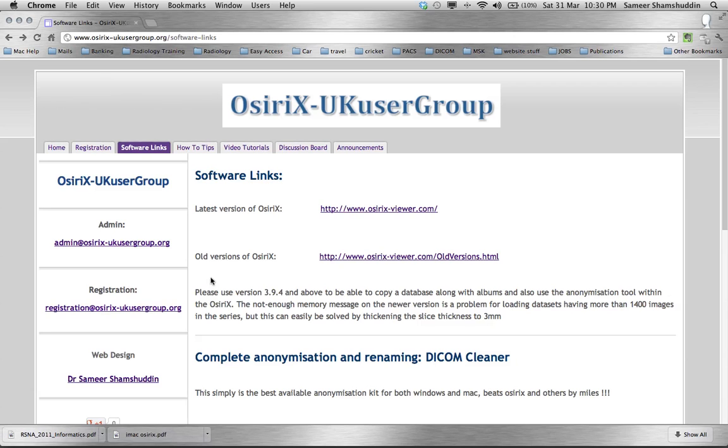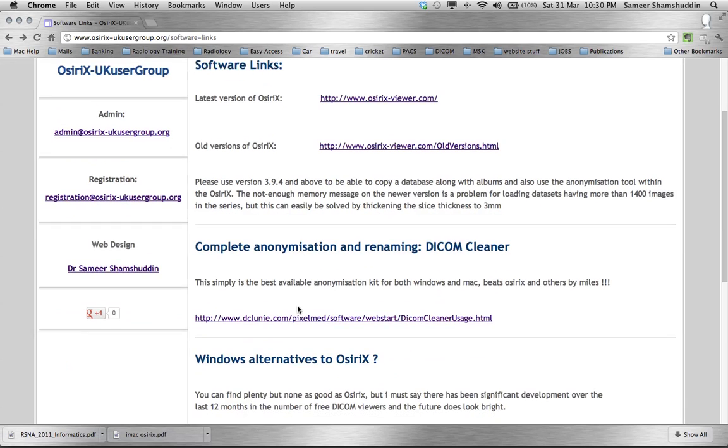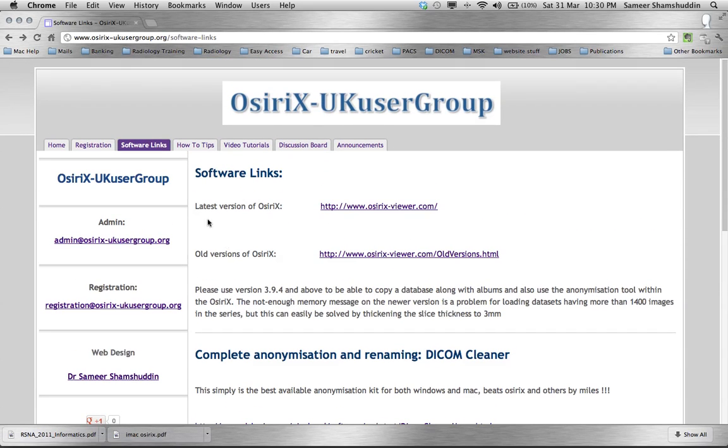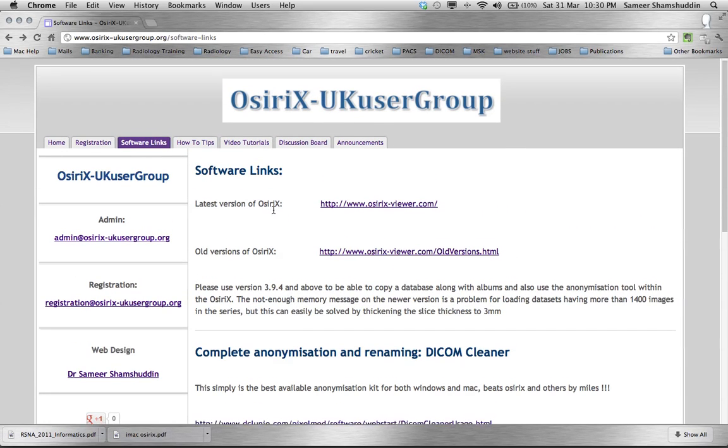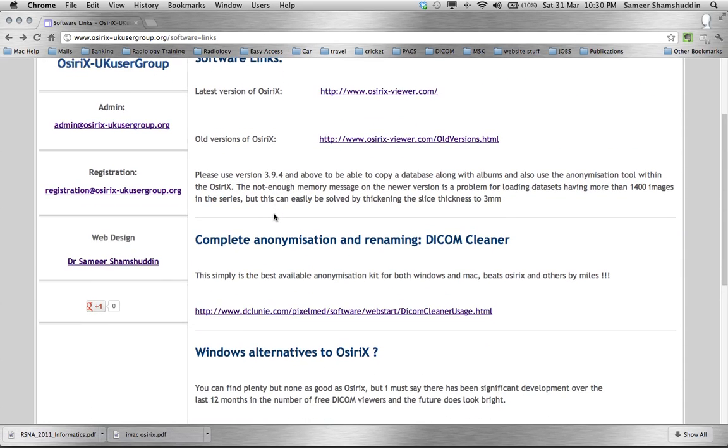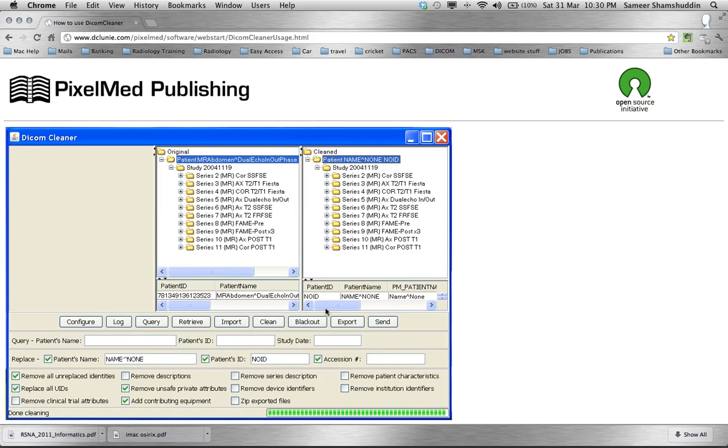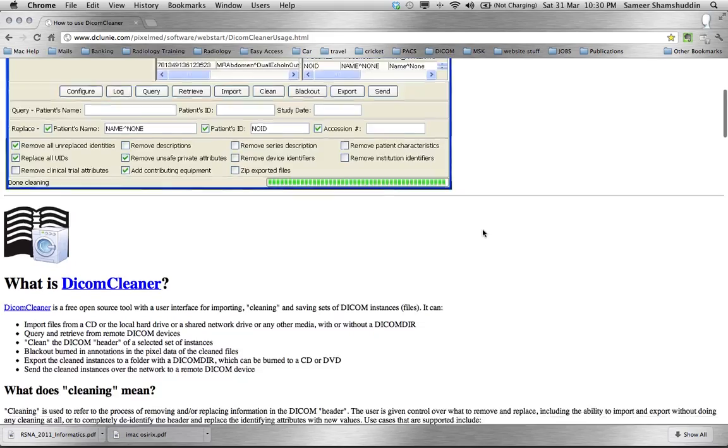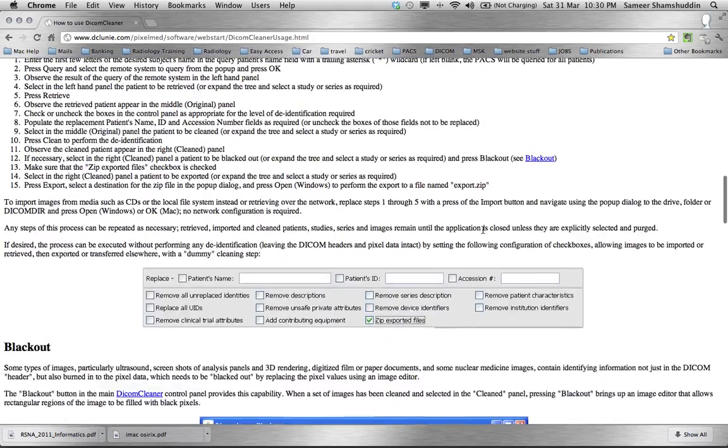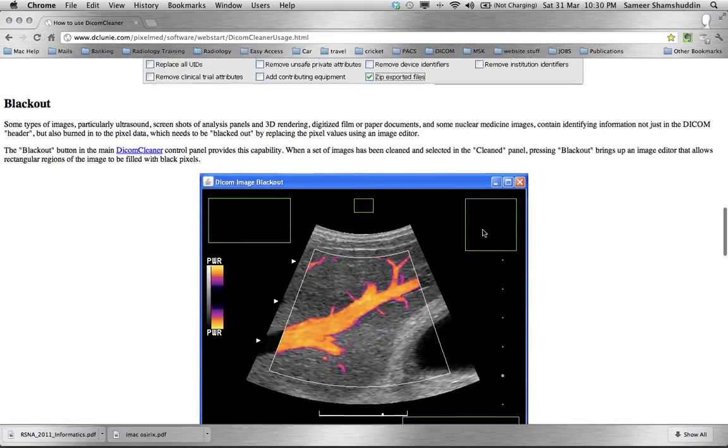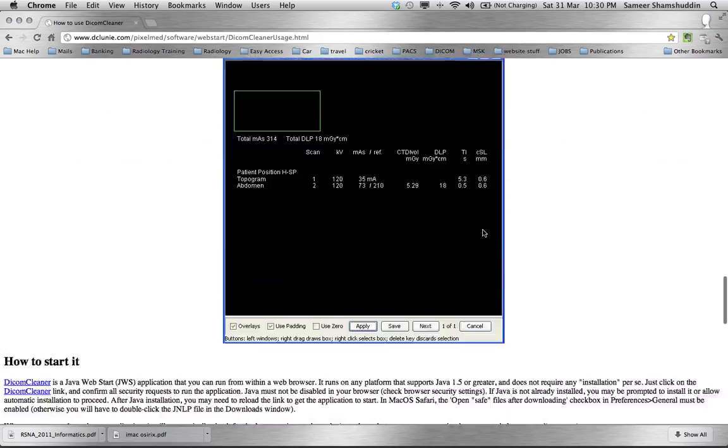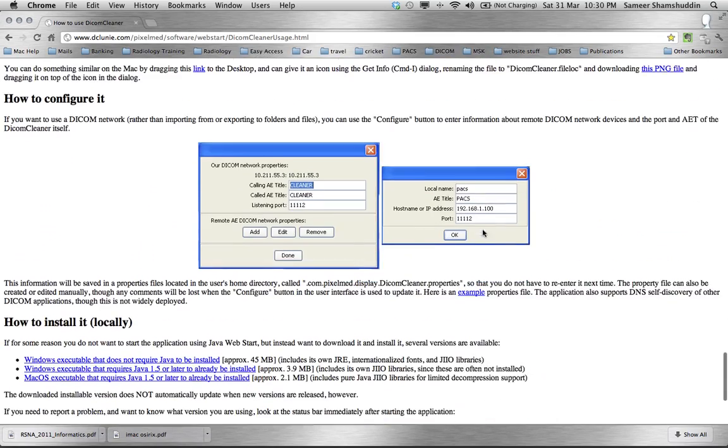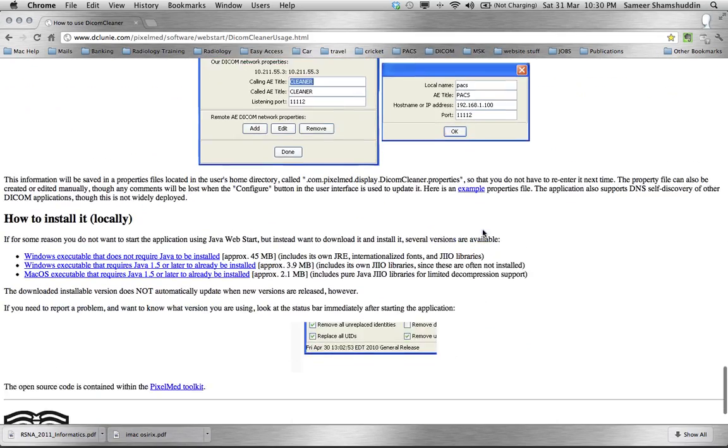This software can be downloaded from this link within the website under software links page. When you scroll down I have put up a link called complete anonymization and renaming DICOM Cleaner. When you click on this link that will take you to the DICOM Cleaner website and if you scroll through the page towards the bottom of the page you will find the link where you can download the software.